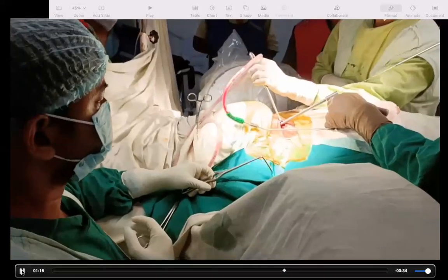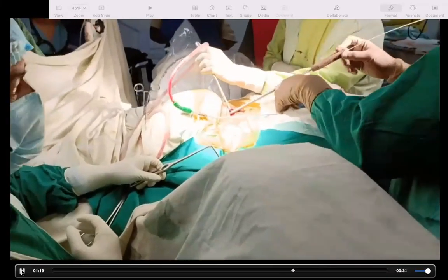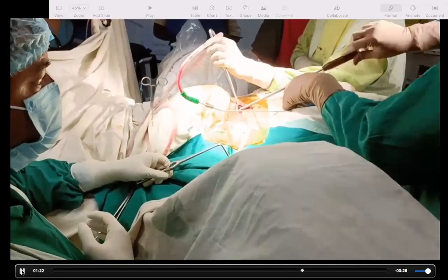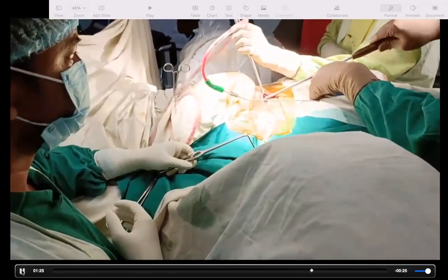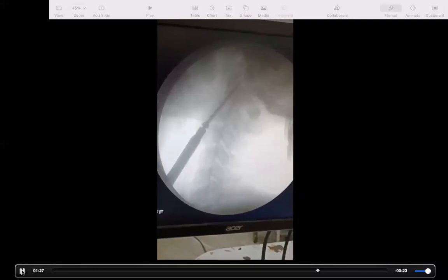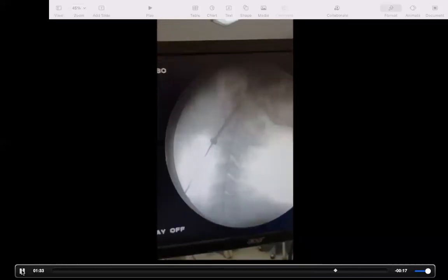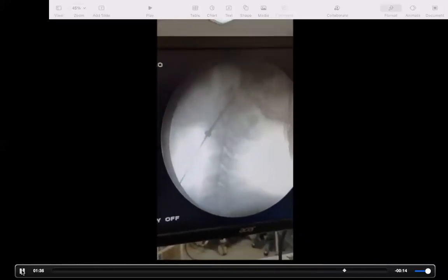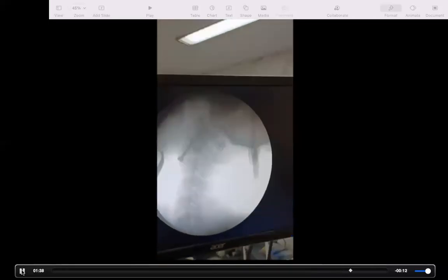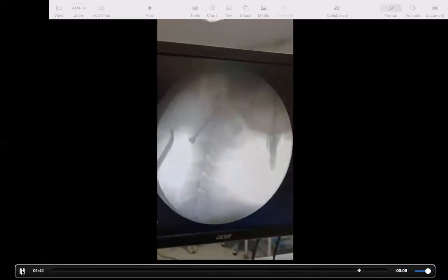The screw length is measured and a lag screw of 38 millimeters is inserted. Further tightening is done to compress the fracture site and to achieve a bicortical hold. The screw is tightened further and the position looks acceptable.